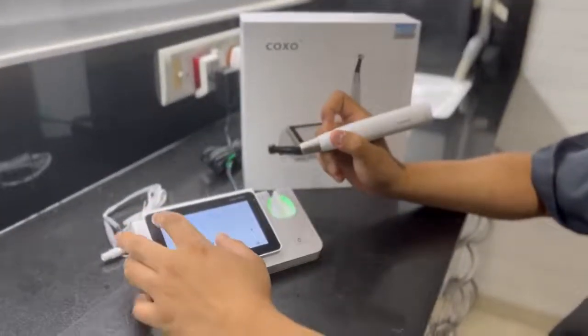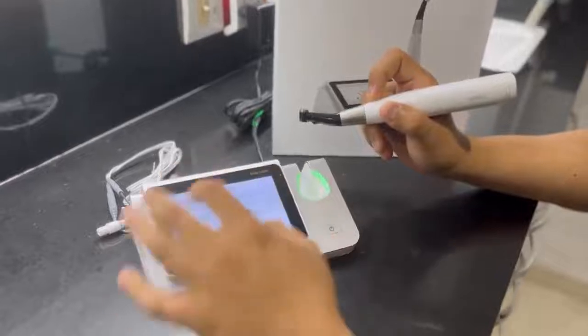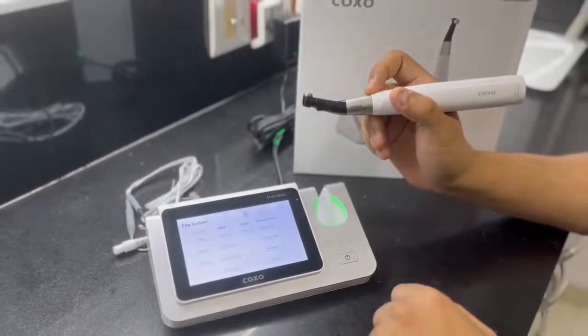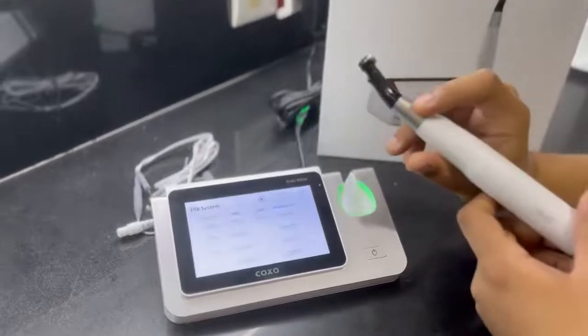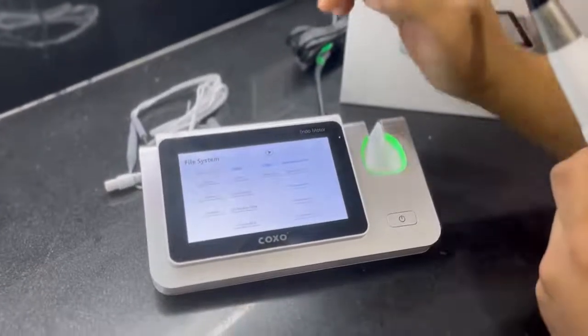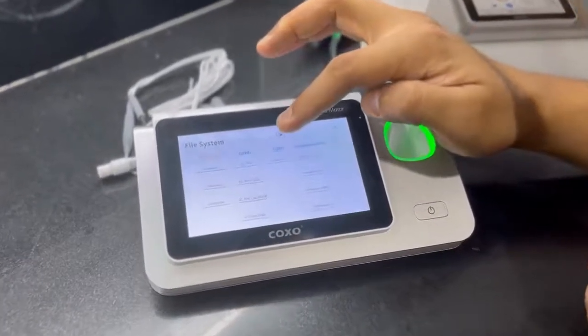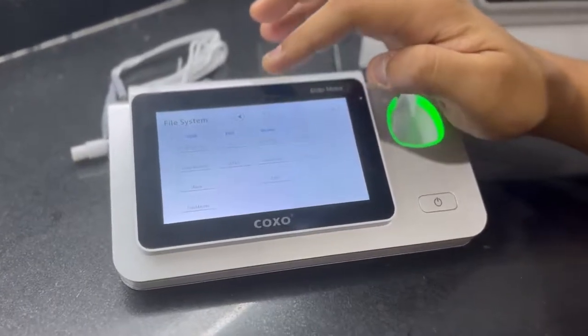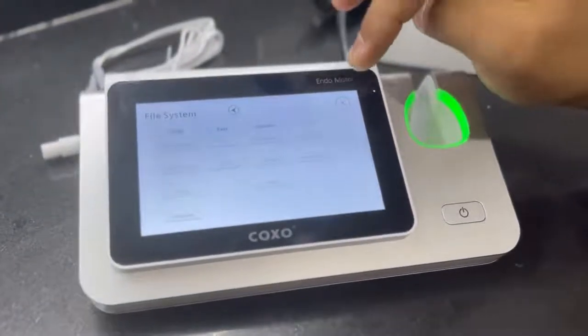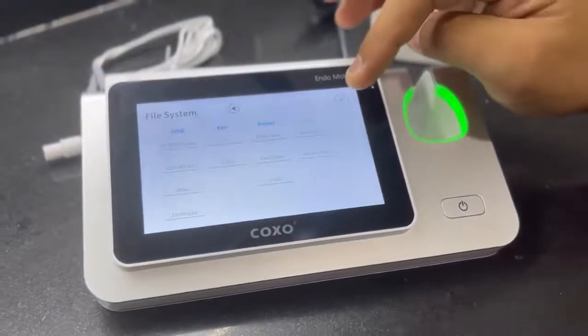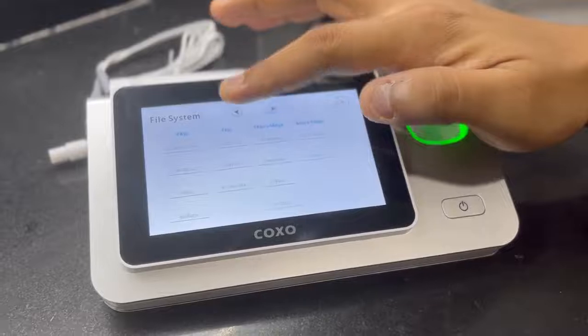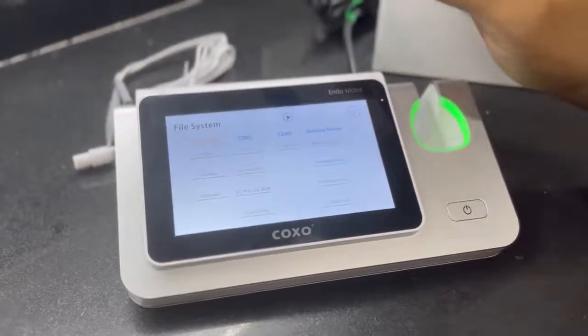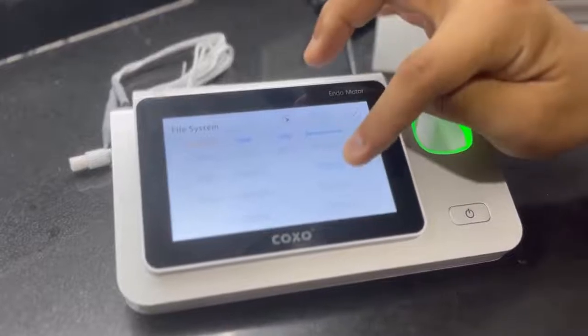So let's have a look at some of the unique features that are there in this device. As you can see, the system supports multiple files. There are presets and programs from companies like Coxo, Dentsply, Sirona, FKG, Micromega, VDW, Kerr, Comet, as well as customized user settings available. So let's look at one of the settings of the file systems that I use, ProTaper Gold.